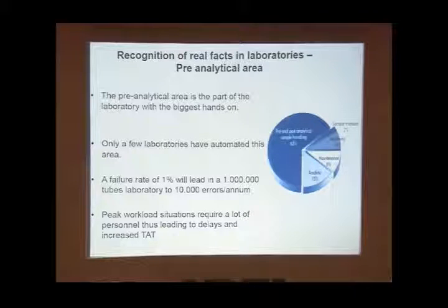Now, this is again a repetition of my earlier slide. The pre-analytical part is the biggest hands-on area where you do maximum work. It is almost 65% pre and post-analytical area. Then the actual analytical work takes only about 15% of our time. And only a few labs have automated the pre-analytical area.